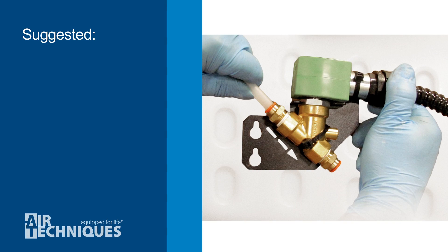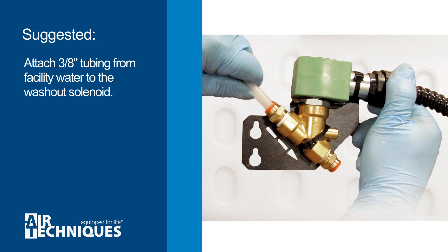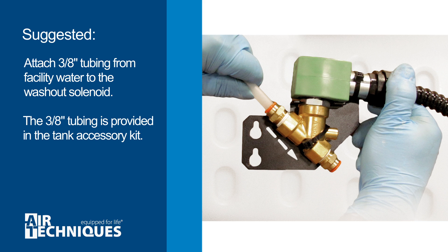Optional but suggested: attach the 3⁄8-inch tubing from the facility water to the washout solenoid. The 3⁄8-inch tubing is provided with the tank accessory kit.